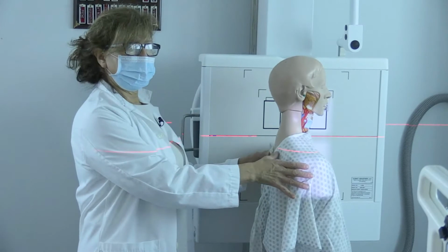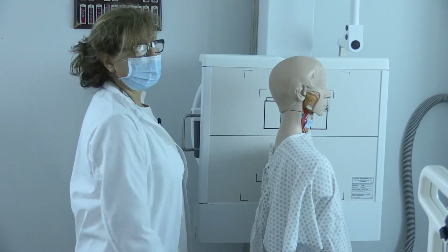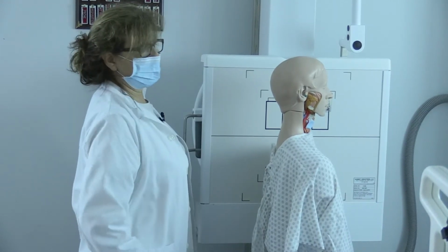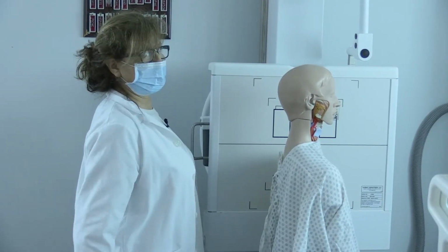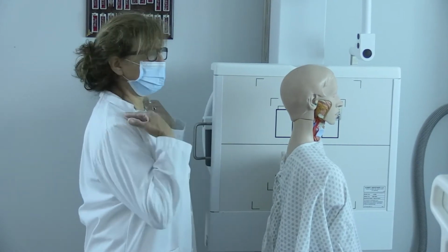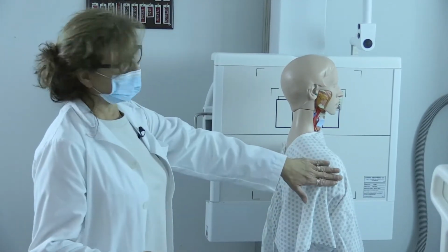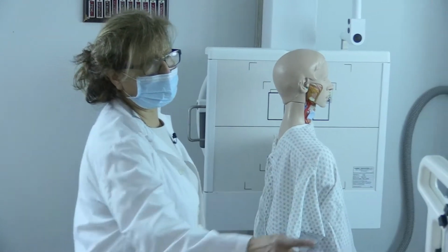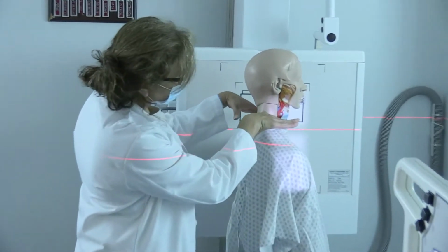As far as the patient positioning, if the patient's shoulders are naturally forward, you may ask the patient to roll their shoulders further forward. If they're standing straight and their shoulders are naturally backwards, ask the patient to roll their shoulders back. This way the shoulders are out of the way of the lower cervical spine. This patient's shoulders look like they're forward, so I would ask this patient to roll their shoulders even further forward. My central ray is going to enter at the level of C4.